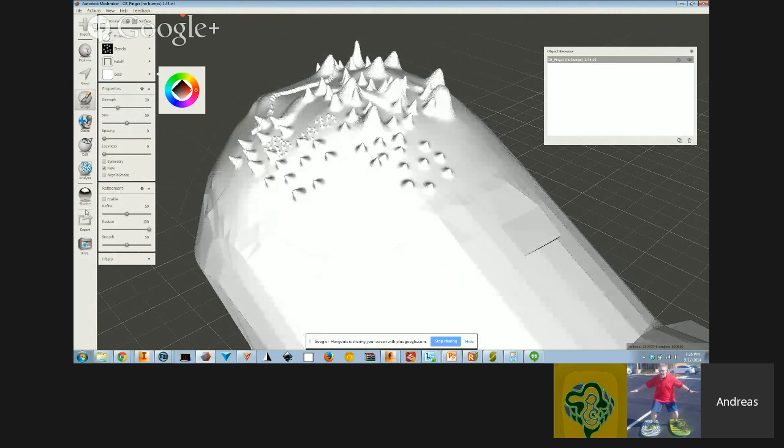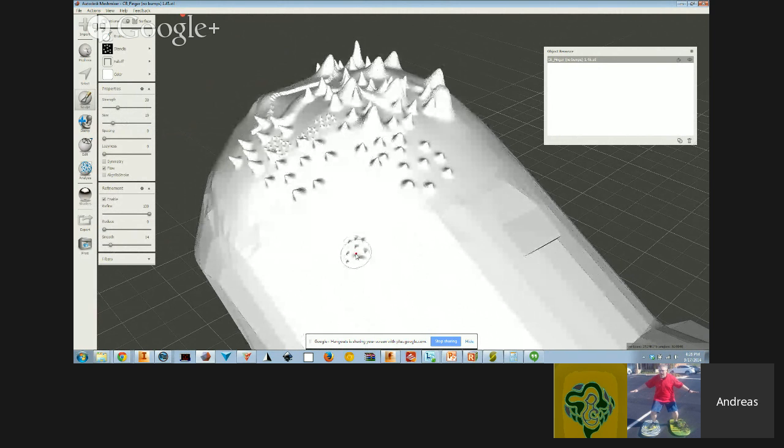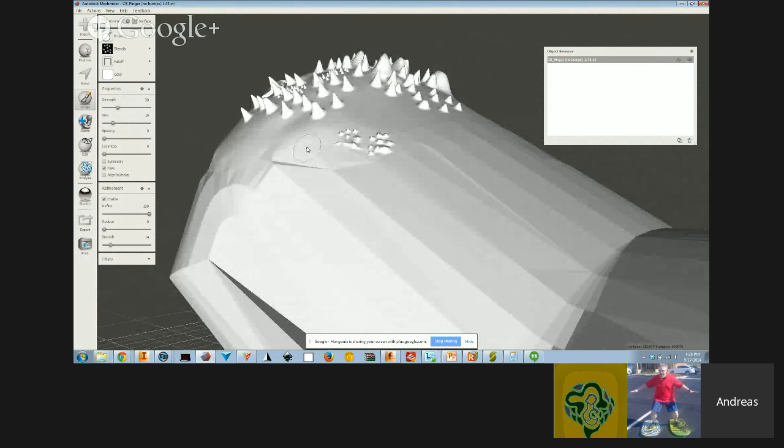So something that's also in here is, you noticed I used the refine brush. You can also do the refinement within the sculpting brush, but I just find it's a little slower. If I increase the refinement and reduce the reduce, watch what happens when I come in here. Let me get a smaller size brush like this. If I come in here, where there's not that many triangles, it'll add triangles for me. So in that case, it doesn't look too bad right there. I just find that it can maybe hinder performance, but in this case, it's not too bad. So I used the refine brush to add all these triangles, but you can actually just enable this refinement down here in the parameters and bump up the refinement and reduce down the reduce and add that stuff on the fly.